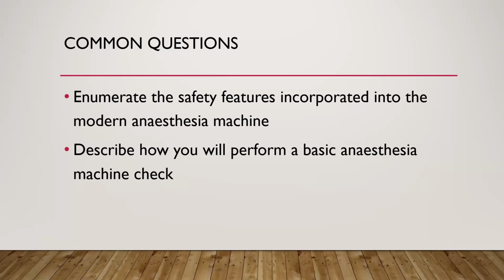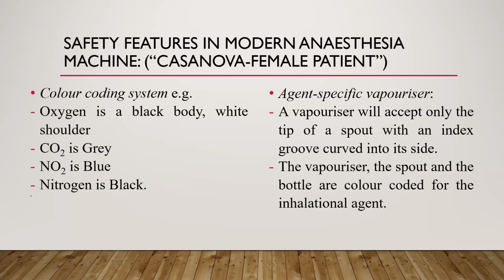Color-coded vaporizer, agent-specific vaporizer. Can you put isoflurane into a sevoflurane vaporizer? No. It's agent-specific. So let's see them. Color coding, correct.